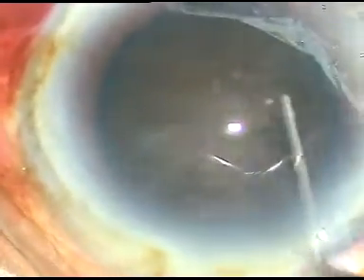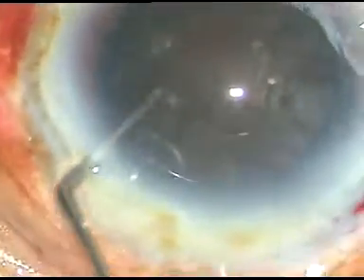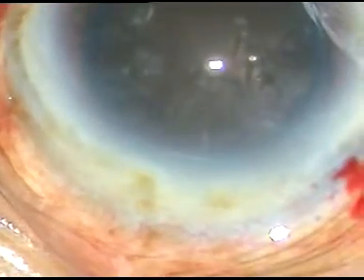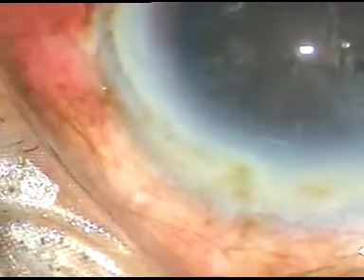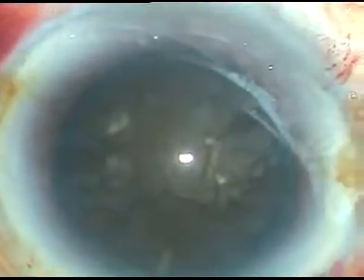I gently tap on the anterior surface of the cataract. I try to rotate it and it rotates freely. Viscoelastic substance is again injected.